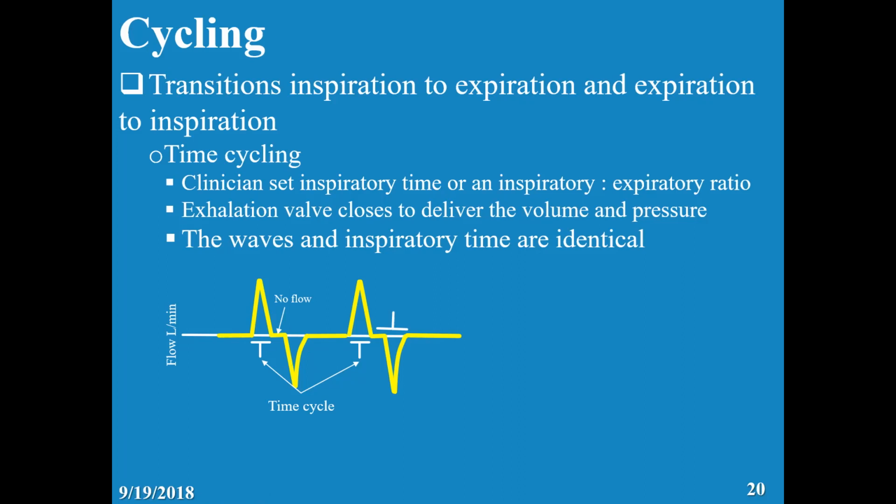Doctor, a question. How do we know on the ventilator that the hold is okay, that it's normal? As I told you, it should not be zero, so going right away, and it should not be prolonged, and the baby is comfortable. The baby is happy, not fighting the ventilator. You don't need much sedation.